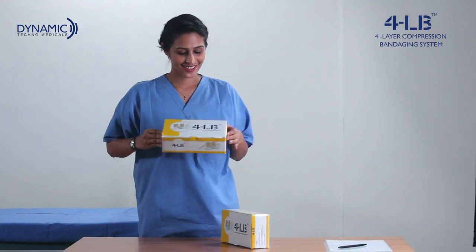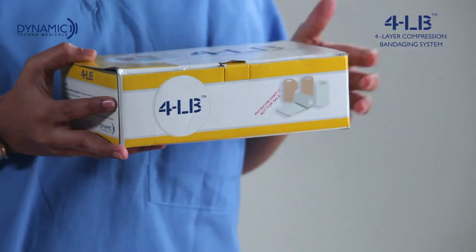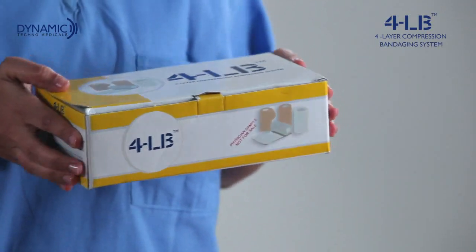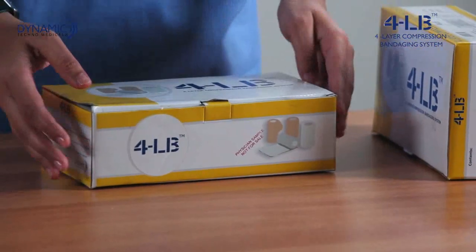Dynamic Techno Medicals presents 4LB. The 4LB kit is a four-layer bandaging system used for the treatment of venous leg ulcers.